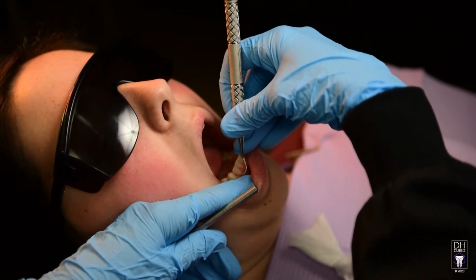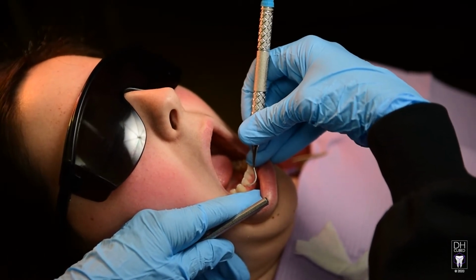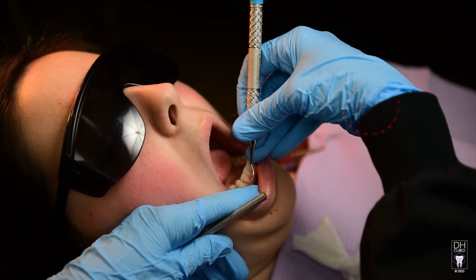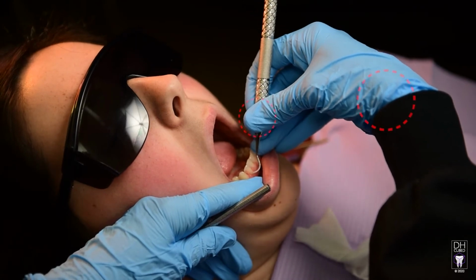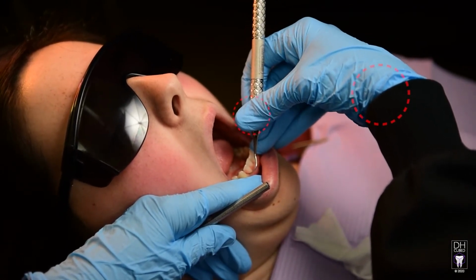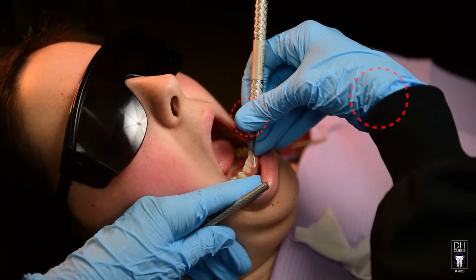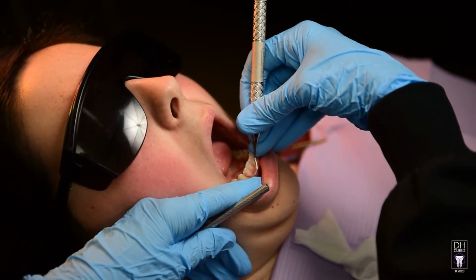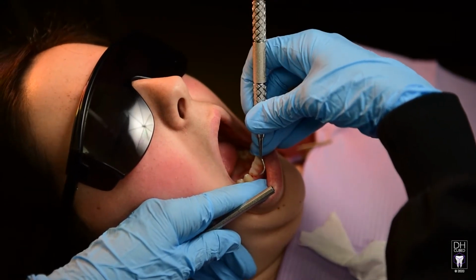This action, the closing of the cutting edge to the tooth in the attempt to get the instrument to bite the surface, is caused by a beveled edge and/or a dull edge. The repeated action of working with the wrist out of neutral and pushing too hard can lead to hand injury over time, and the patient will experience a heavy-handed hygienist. Therefore, train yourself to notice the minute you start to close the blade and/or push harder. Use this as a clue to stop and sharpen.